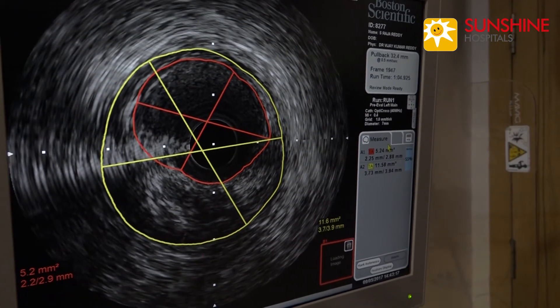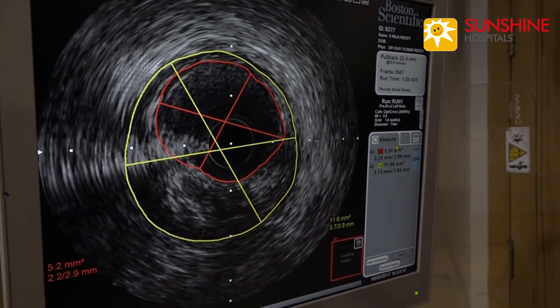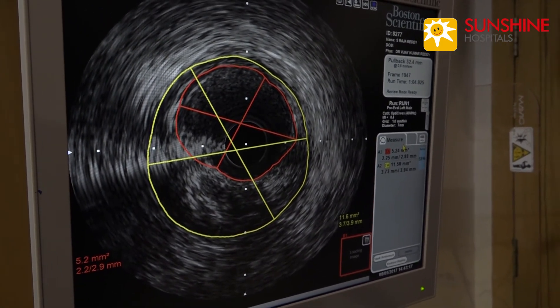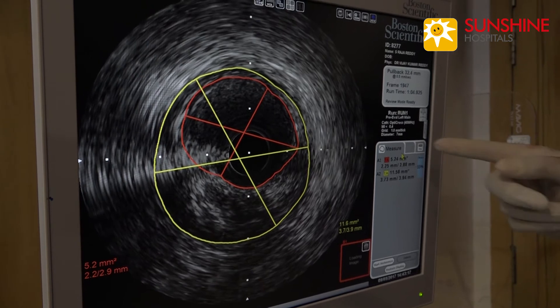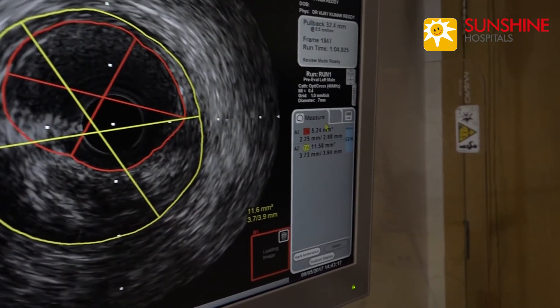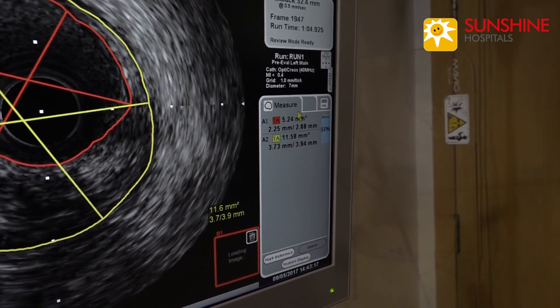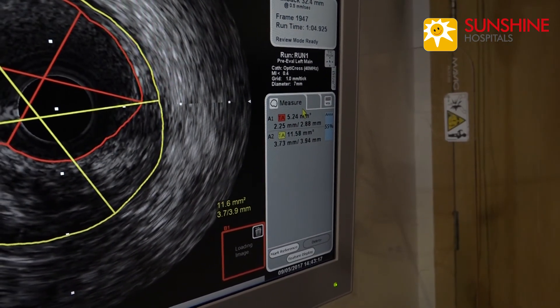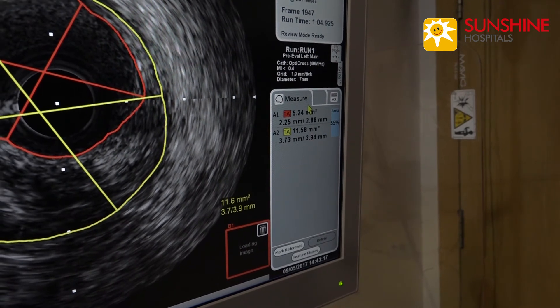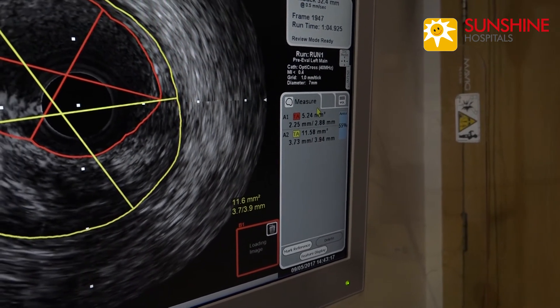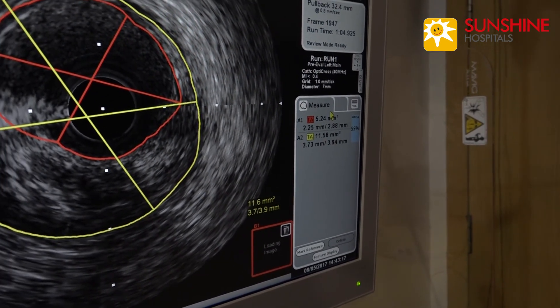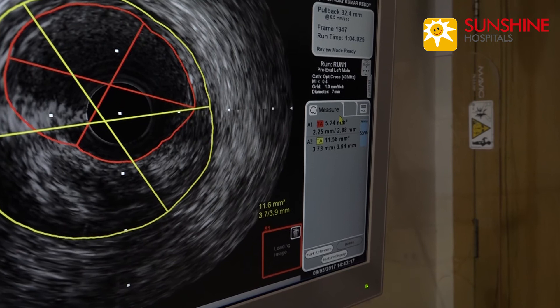We can also measure by IVUS the histology — the lipid component, whether it is necrotic, whether it is fibrotic, whether it is calcific — all these things we can identify. That is called virtual histology.